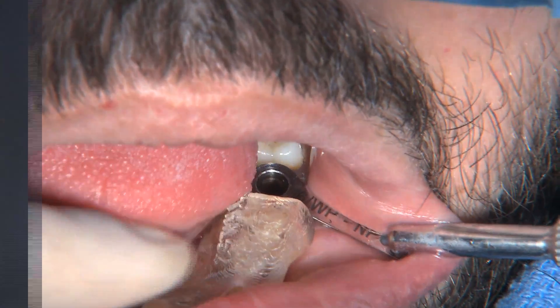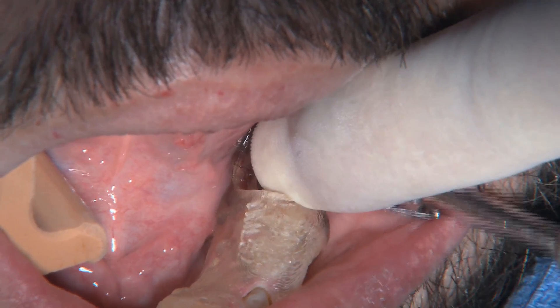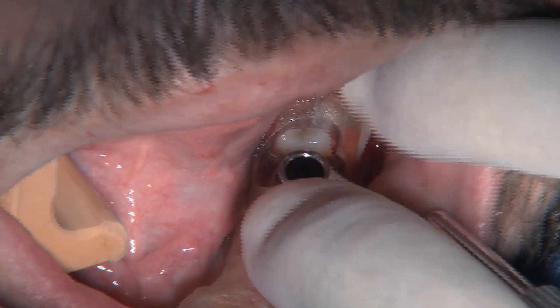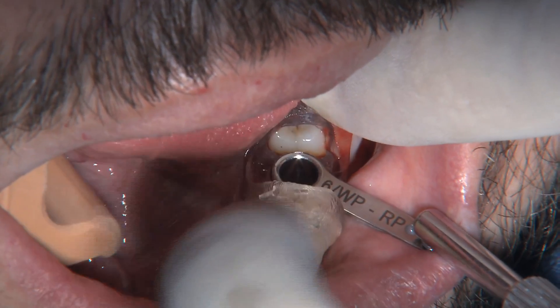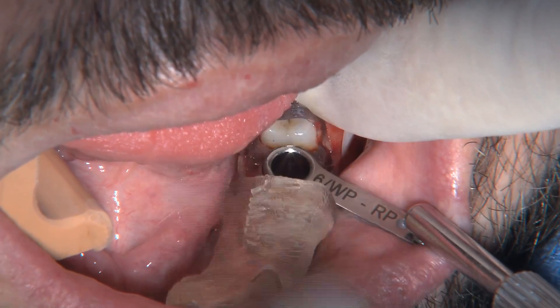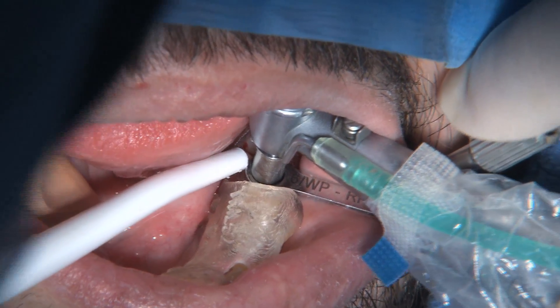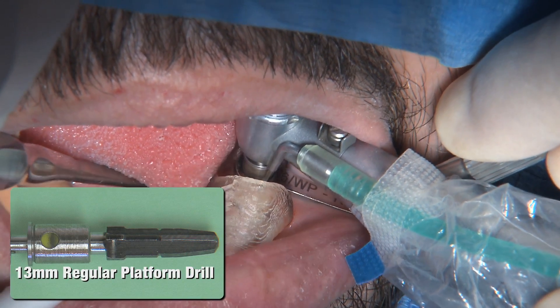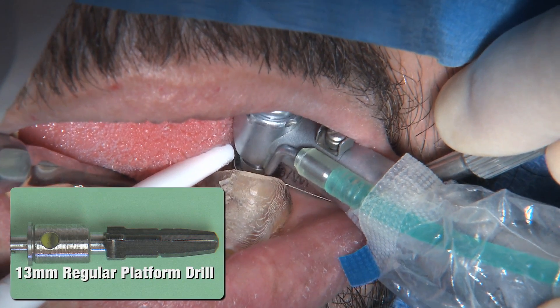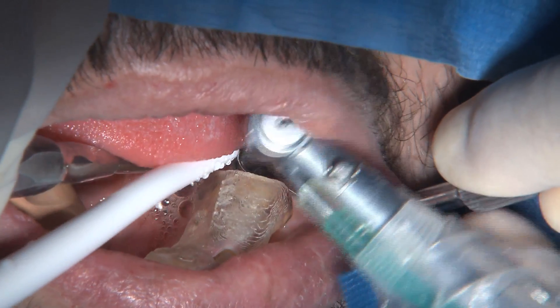As I work through the series of drills, I can take them all to their full depth with confidence that I'm not doing any damage and that the osteotomy being created is in the correct anatomical location. I push the surgical stent down to make sure it's all the way down — you can see the adjacent molar showing through — and then go in with the 13 millimeter regular platform drill, taking that to full depth until the bur simply will not go down any farther apically.